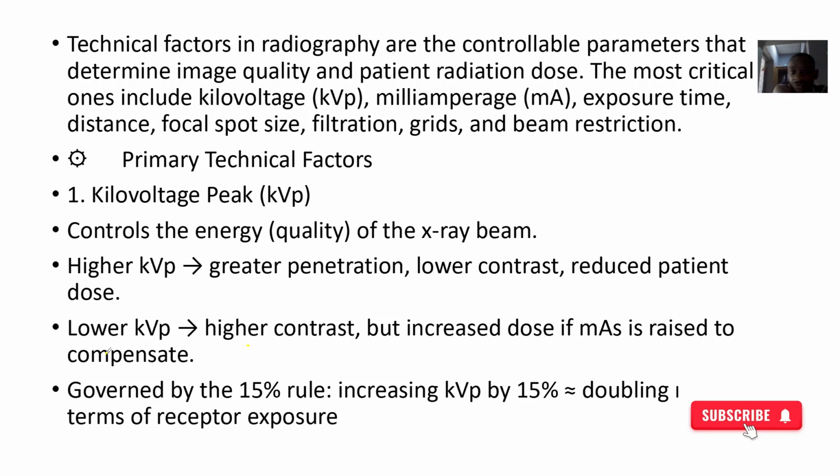So things that you should consider include kilovolt peak, which controls the energy quality of the X-ray beam. The higher the kilovolt peak, the greater the penetration. The lower the kilovolt peak, the higher the contrast and all of that. So that's what we got.